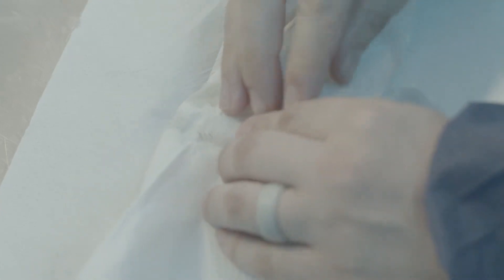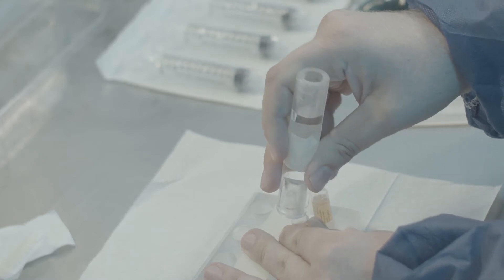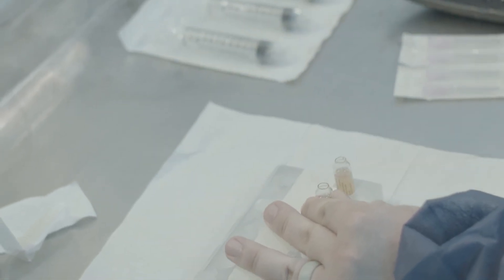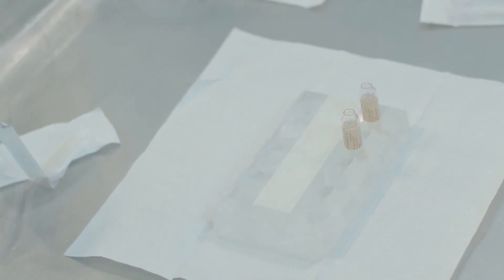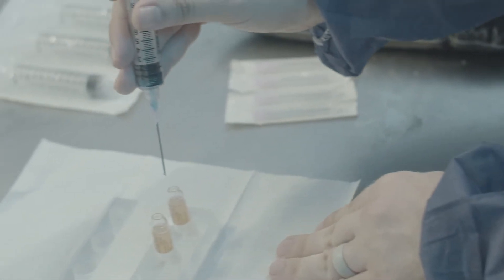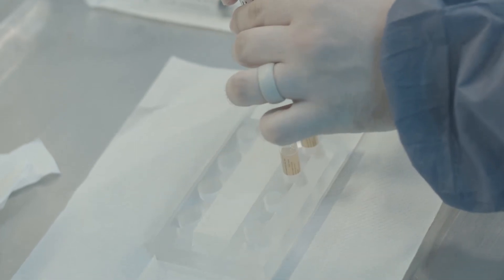Immediately after thawing and before opening the ampoule, dry hands and ampoule with a clean paper towel. Use a new paper towel with each thawing sequence of four or fewer ampoules. Next, open ampoules by pointing the top of the ampoule away from the face and body and carefully break the ampoule at the neck. Do not spill the contents. Then, using the 20-milliliter syringe containing buffered diluent, begin the process to remove the vaccine from the ampoules. Do not allow the needle to touch the outside of the ampoule or any other surface except the inside of the ampoule or the septum of the vaccine bag.